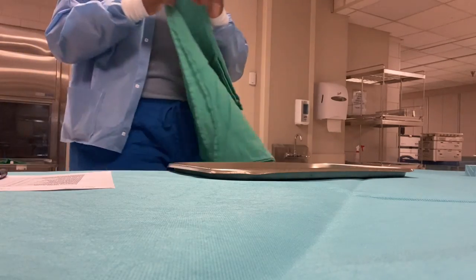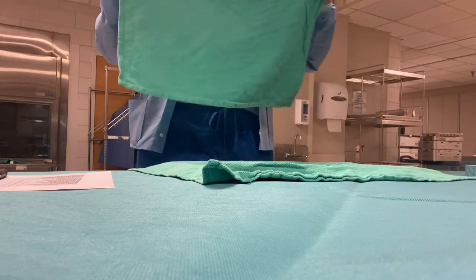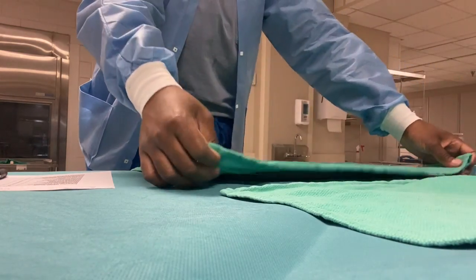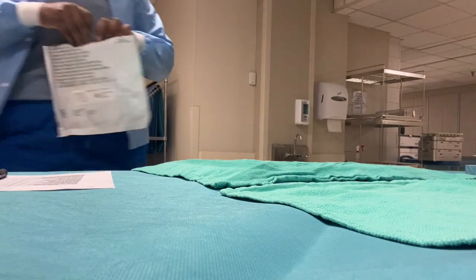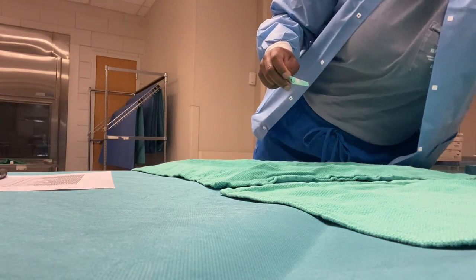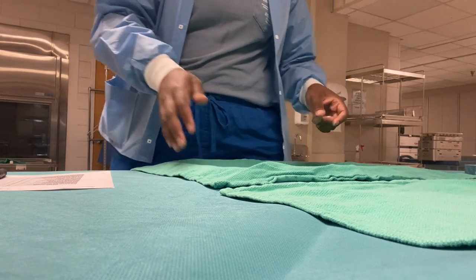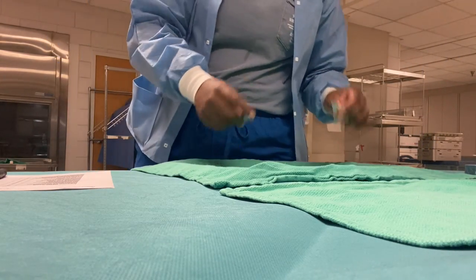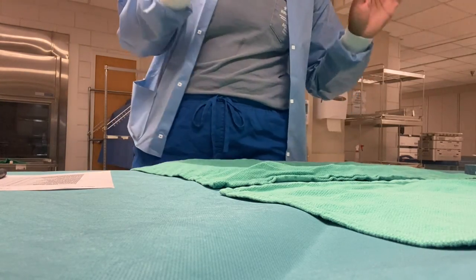This one only requires two towels. So I'm gonna lay my first towel down, put my other towel at the top. I always put your indicators first because if it can't get to the OR with no indicators, that's the worst. Y'all, that is really, really bad. So I always remember to make that one of the first things I do.